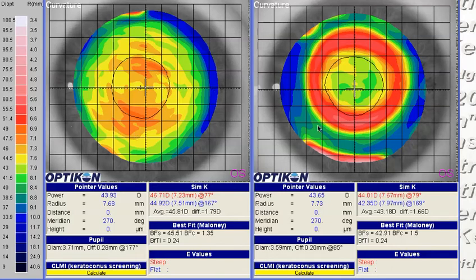this patient. On the post-wear map, there is a little bit of looseness again in the vertical meridian. The treatment zone is shifted slightly superiorly, so perhaps steepening the periphery could drop this lens down a little bit, maybe give you slightly better centration. Although if the patient isn't really complaining of glare anymore, I'm not sure I'd really do that. I think what I'll do is just, for demonstration purposes, show you how I would steepen the periphery. Not necessarily as an indication that you should do it, but just in case you wanted to.